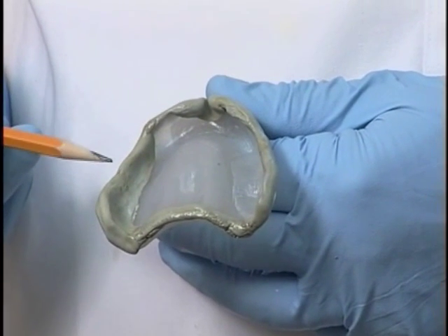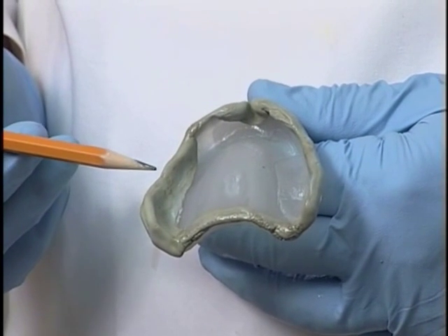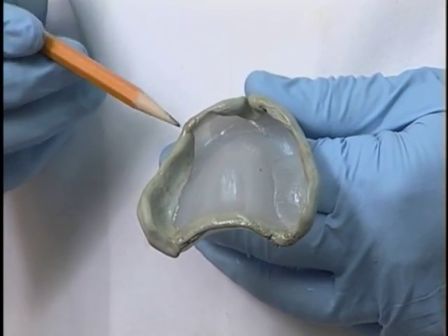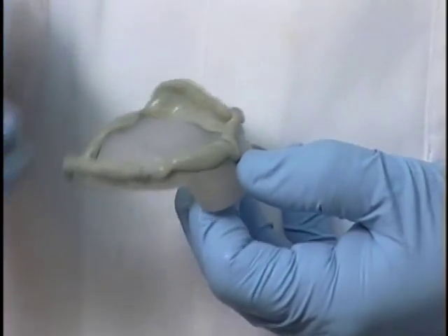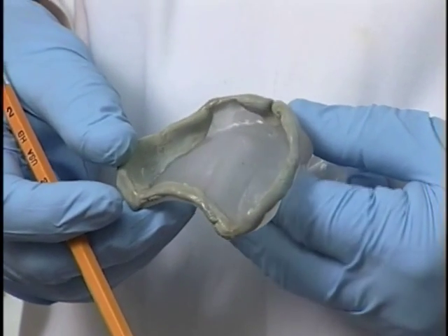If it comes out with tray showing through, that means that our tray was too long and it needed further trimming before we did our border molding. So we can see that this came out very nice and rounded, no tray showing through all the way around. It has a very nice replication of the labial frenum. And we have a nice rounded periphery all the way around without any tray showing through.